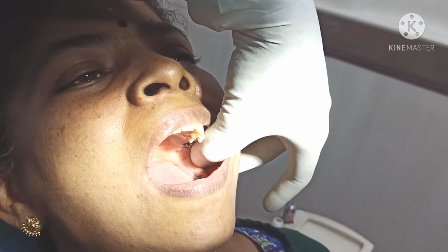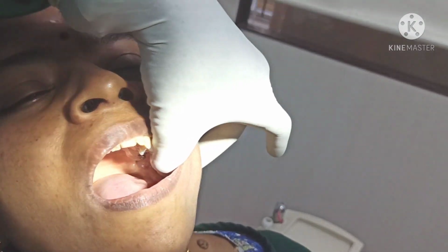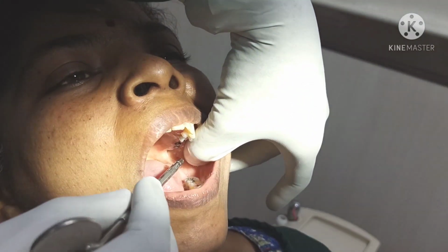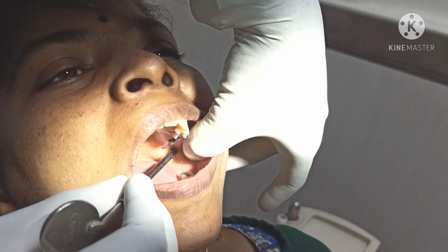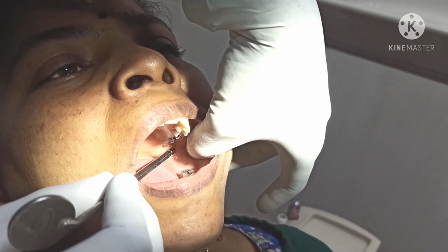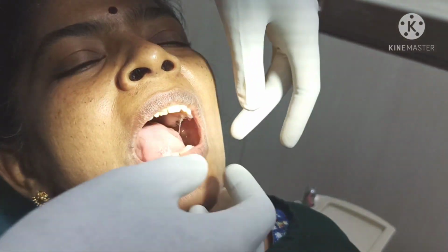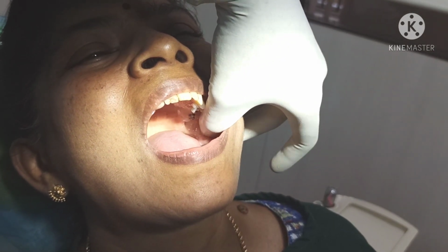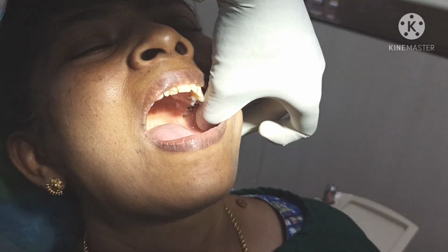If the width of the ramus is less, your depth of insertion will be less. If the width is more, then the depth of insertion will be more. So mentally you have to visually imagine that our target area is about 2/3 from the anterior border of the ramus. This is one more thing we can do. So start palpating and visualizing the width of the ramus for all patients. After 30 or 40 patients, you will get a fair idea.